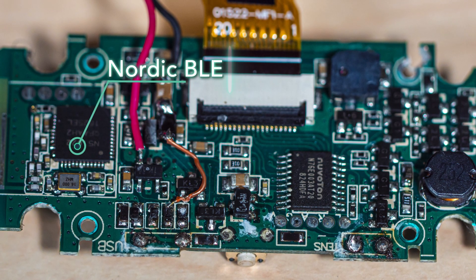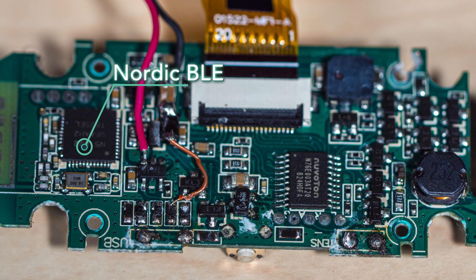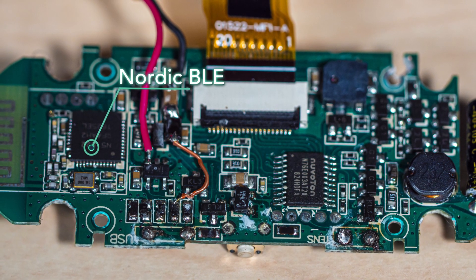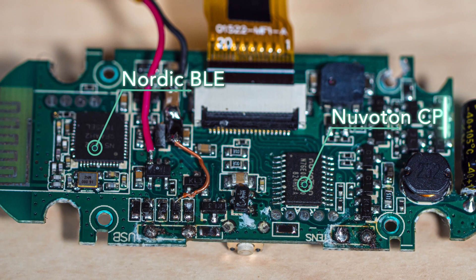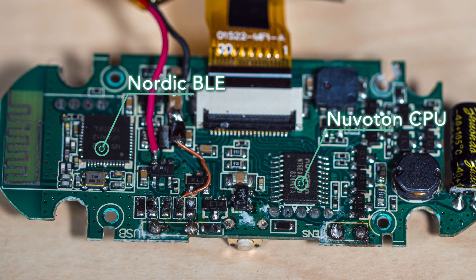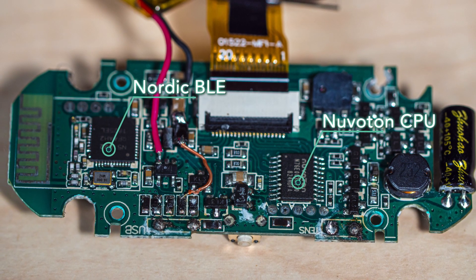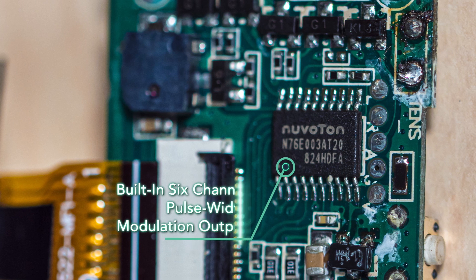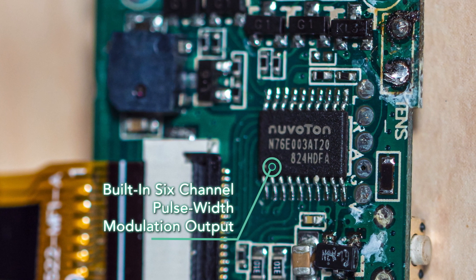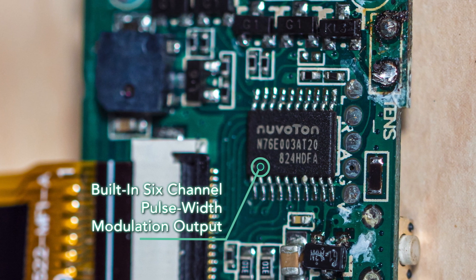Two ICs run the whole show. One is an NRF51822 SoC Bluetooth low-energy device from Nordic Semiconductor. This chip contains an ARM Cortex-type CPU. The brains of the device is an N76E003 chip from Nuvoton in Taiwan. This chip basically mimics the instruction set and architecture of the old 8051 processor, originally from Motorola. One particular aspect of the 8051 architecture worth noting is the built-in six-channel pulse width modulation output, which would seem to come in handy for developing the various square wave signals necessary for driving the electrode pads.